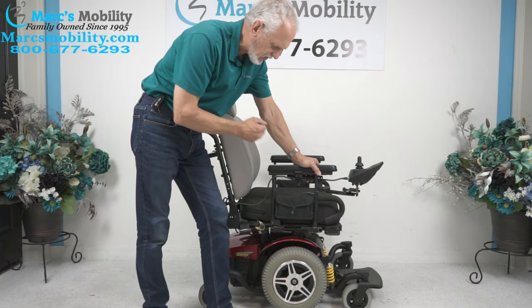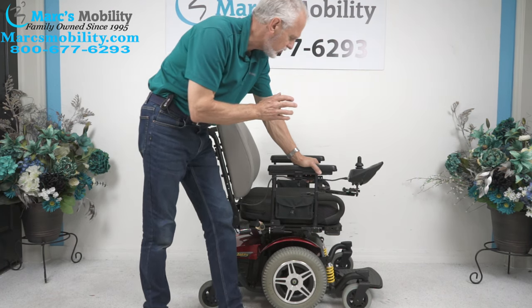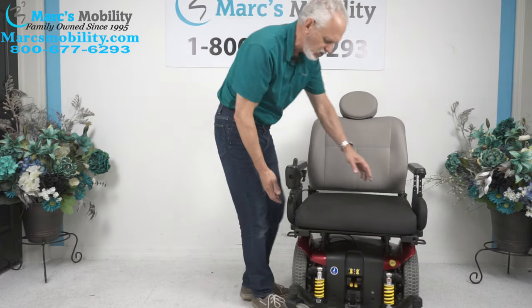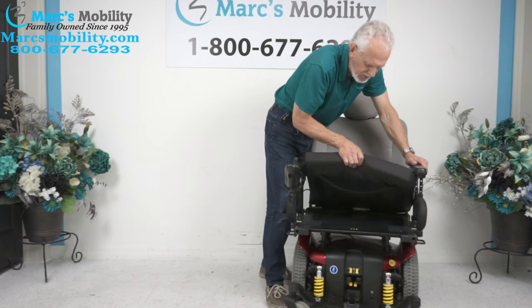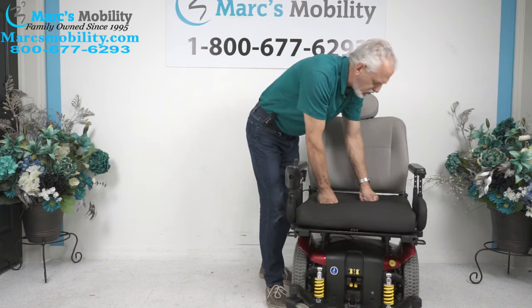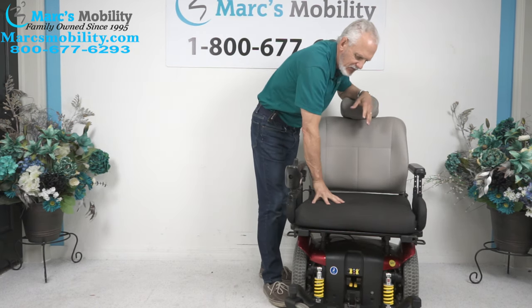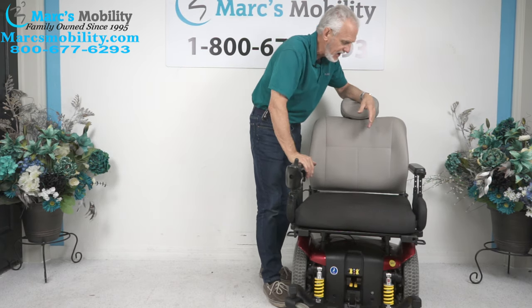So if you wanted something with a little bit better seating than what normally comes with it — and this is unusual — this seat on this chair, as you can see, is 22 inches by 20 deep. It has a floating cushion, a really soft, nice large cushion. This is called a rehab seat, and it came with the chair — that's the way they ordered it.